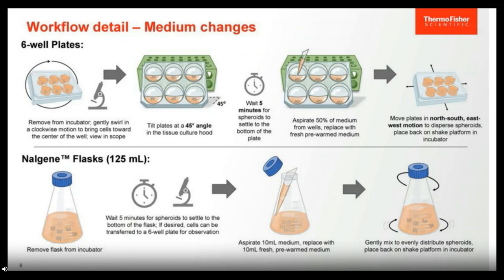So after seeding the suspension cultures on day 0, the cultures will need to be fed on the subsequent day. And because these suspension cultures have formed spheroids overnight, we can use gravity sedimentation to collect spheroids at the bottom of the well or the flask, thereby enabling medium exchange from the top of the vessel. The gravity sedimentation should occur for approximately 5 minutes in order to minimize the amount of time the spheroids have been clumped at the bottom of the well.